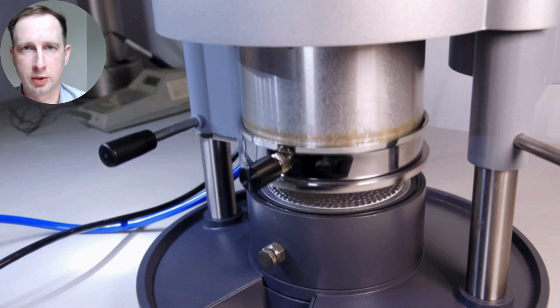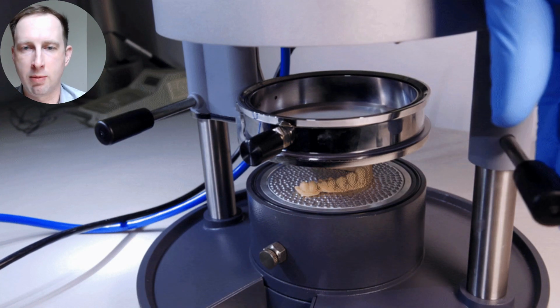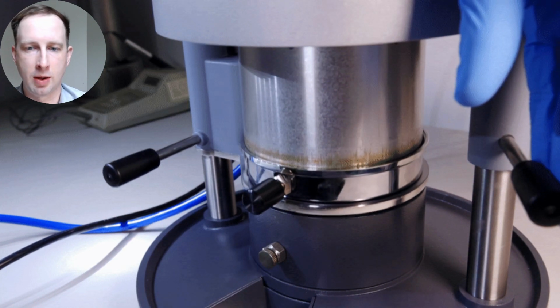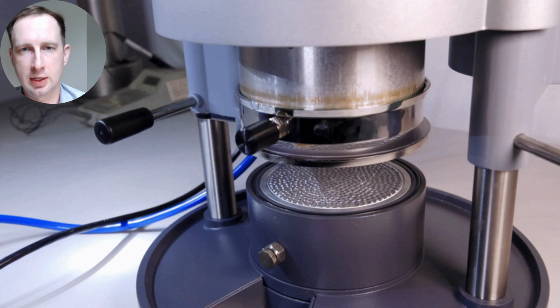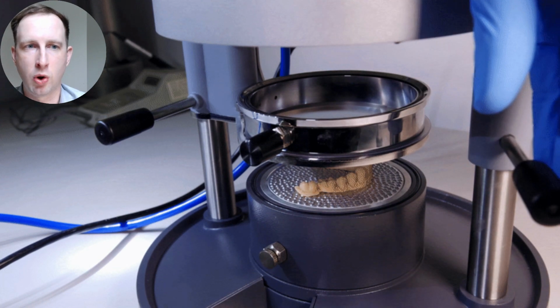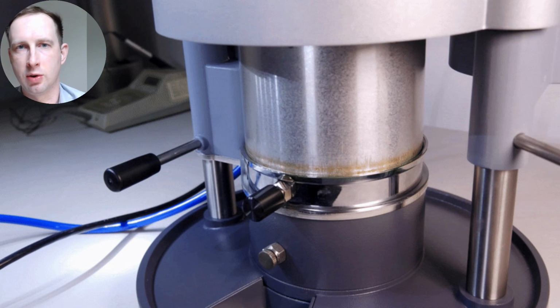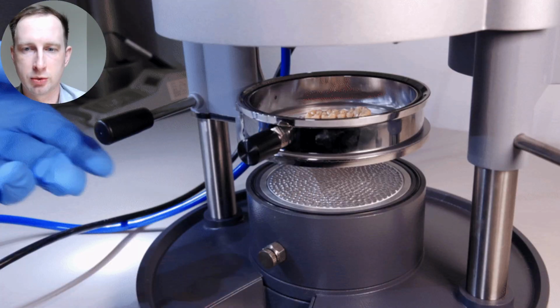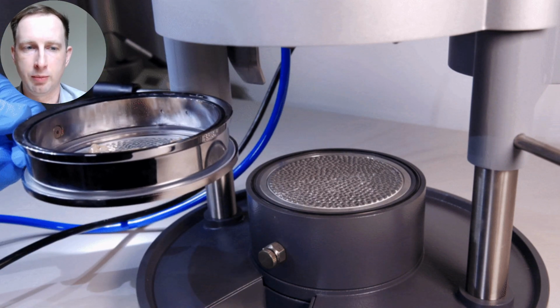The thicker the material is, typically has more memory, it can apply more force to the teeth, as opposed to thinner. And you've got to remember, when you're stretching and heating these plastics over the model, they do thin out a bit. So when you get a 1 millimeter sheet thermoformed like this, it'll thin down to about 0.7 millimeters, which is important to note. So once you have that thermoformed part, you pull it out.